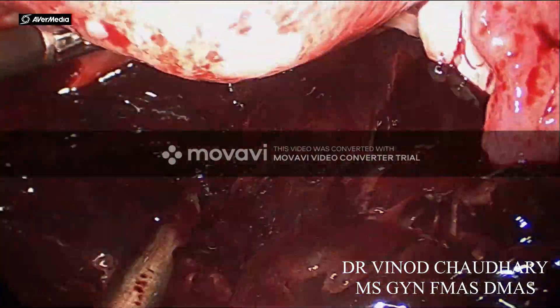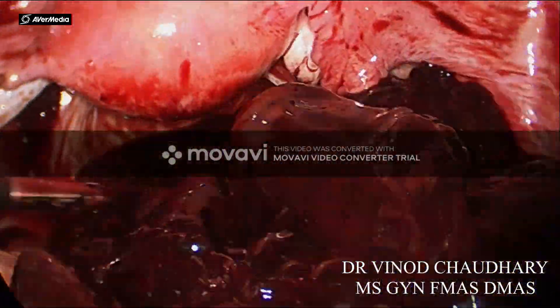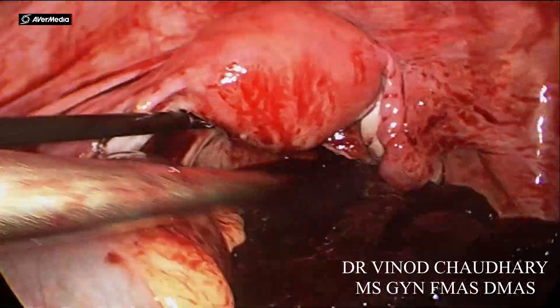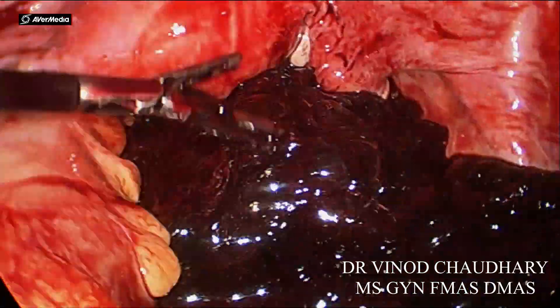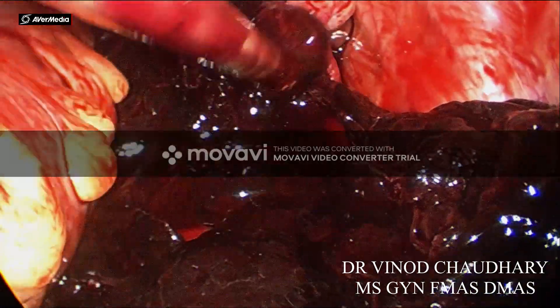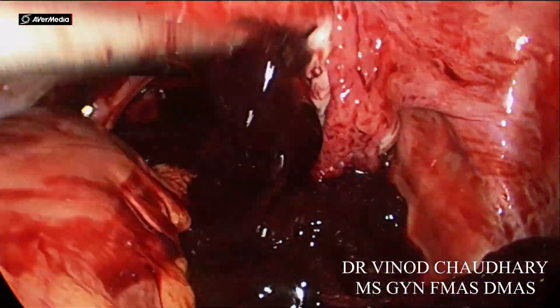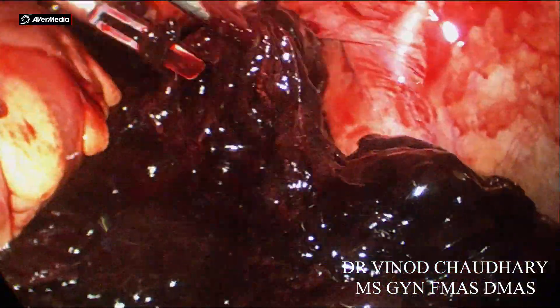I have fast-forwarded this part because it is continuous suctioning. The heparin did the job, but as you can see this is a very large clot — it is very difficult to dissolve with only 100 ml of diluted heparin. Afterward we used a 10 mm suction.